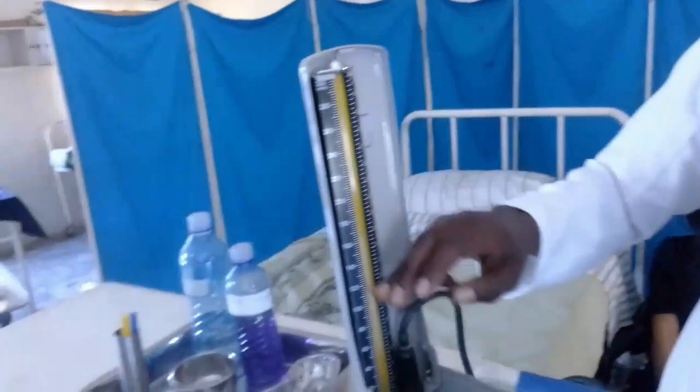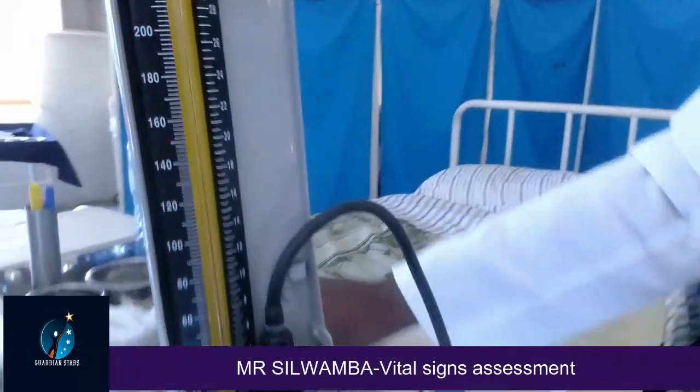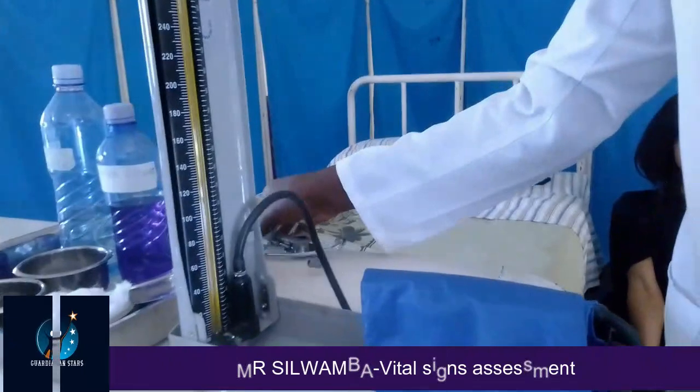Okay. So from respirations, we move to blood pressure. This is just a summary to give you an idea, but there is more to vital signs which you have to study. So let's look at blood pressure. You can take it using a digital BP machine, or you can use a cardiac monitor, or you can use a sphygmomanometer. This one uses mercury, so you'll be able to see what it does.